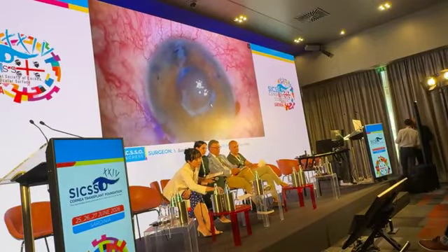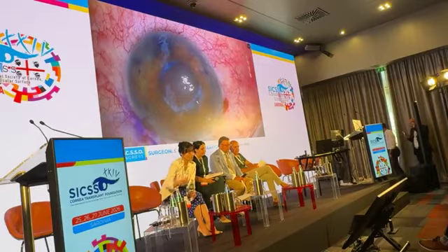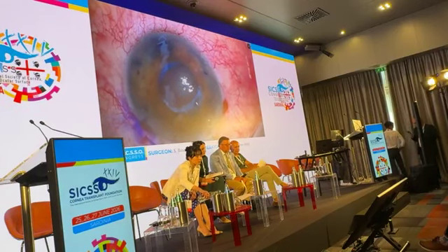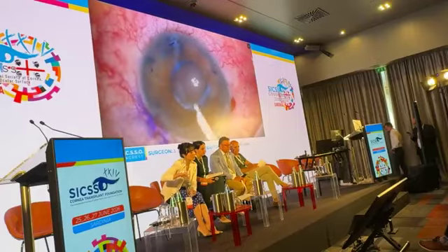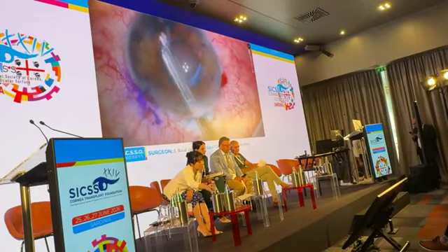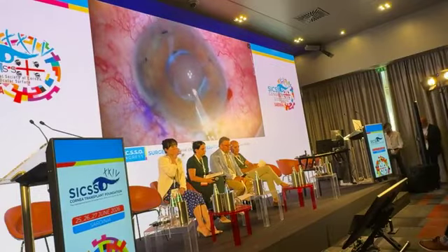He has started with a mark on the outer corneal surface of 8.5 millimeter diameter, performed 2 side ports and the main incision, a post-limbal main incision. Did a little bit of cautery to avoid bleeding during the following procedure. He has put a bit of trypan blue in the AC to visualize the Descemet membrane.